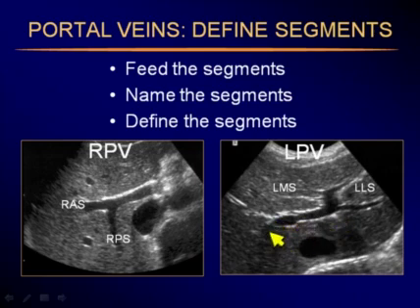Now here, after the vein splits from the main portal vein, the left portal vein has a longer course. It travels towards the left lobe and suddenly takes an abrupt anterior turn. This is the only part of the portal system that suddenly aims anteriorly. Okay, that's the umbilical segment of the left portal vein, and it sends off lateral branches and medial branches. So this would be the medial segment of the left lobe, and these are lateral segments of the left lobe.